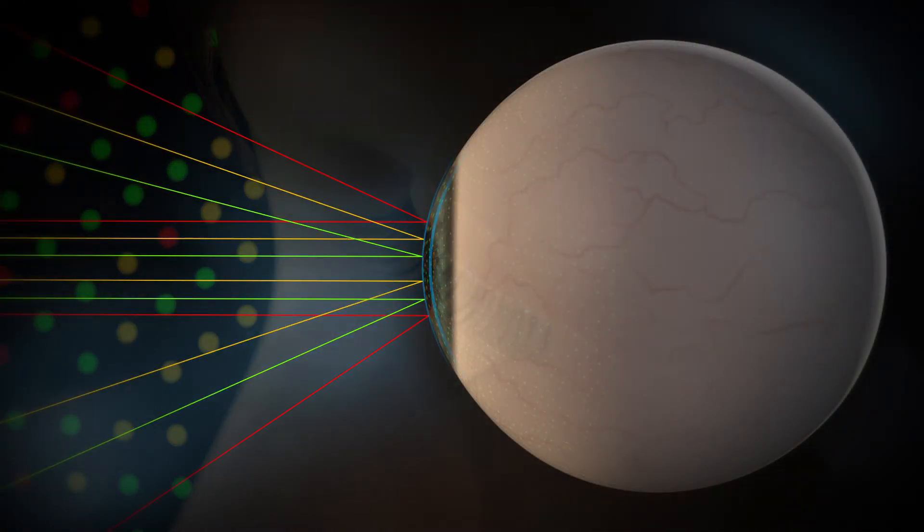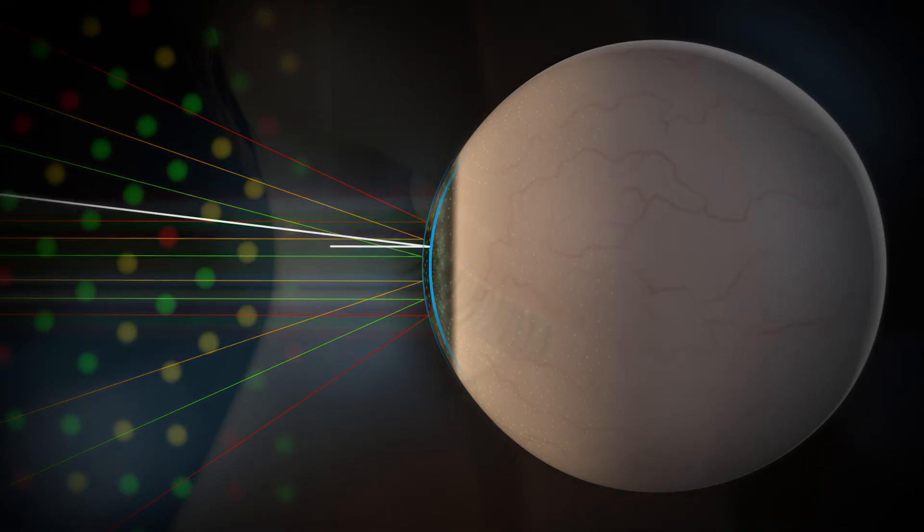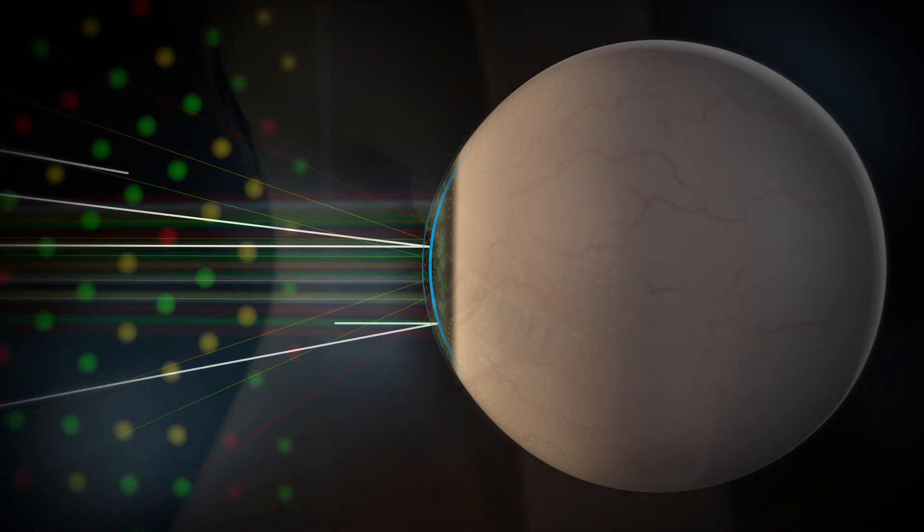The posterior corneal surface is reconstructed by detecting the second Purkinje reflections of the infrared LEDs.